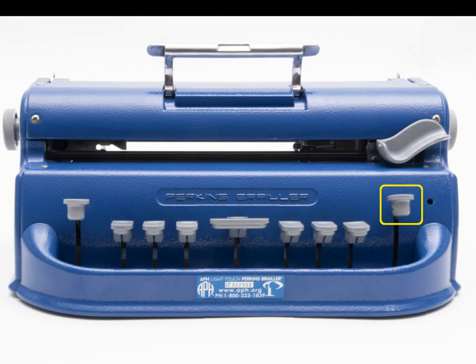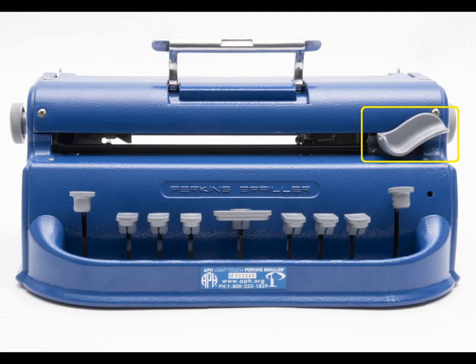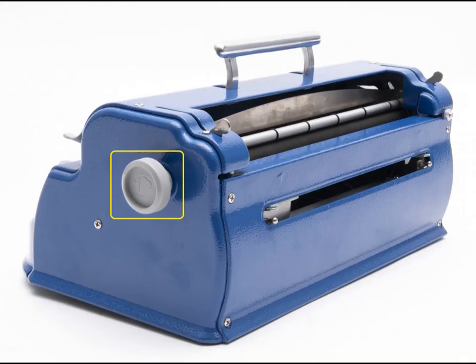The next part is called the carriage lever, and it is responsible for the placement of the embossing head. This essentially means that it controls where you're typing next, just like how the cursor on your computer controls where you will be typing. The embossing head is what actually creates and writes the Braille when you hit any of the dot keys.